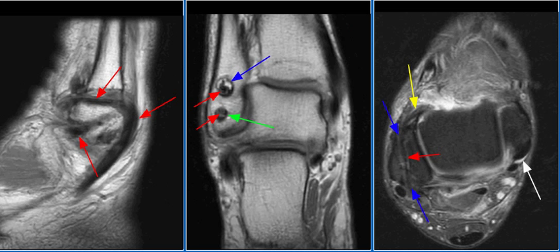These findings are consistent with lateral ankle ligament reconstruction, with a partial split tear of the peroneus brevis tendon. The reconstructed ligament is however intact.